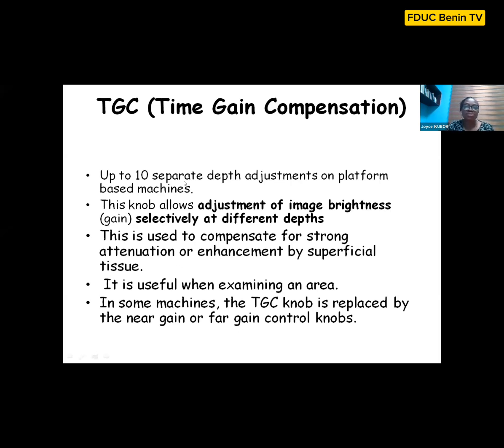On some machines, this time gain compensation is known as near gain or far gain control. So it depends on the machine, but all of them have the same function.